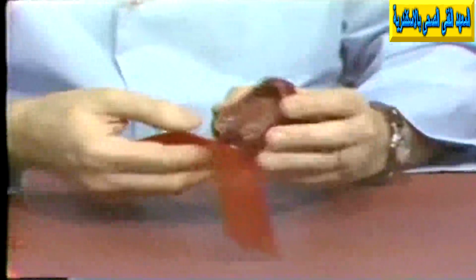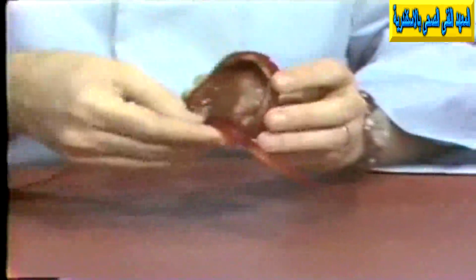Now, this wax strip is added in such a way that we get the proper thickness to our stone model when we pour up the cast. And in a moment, you can see how that is effective. Now, we simply lightly place the wax strip around the impression once to tell ourselves whether we have done it correctly or not. In this case, you can see the wax strips don't meet, and as I put it on the table, I can see that the impression is not sitting level on the table.